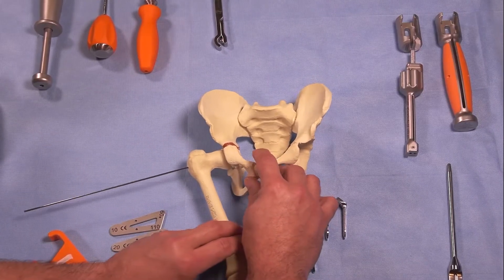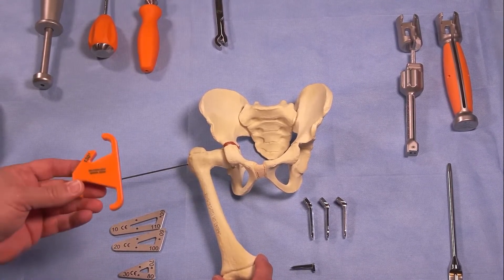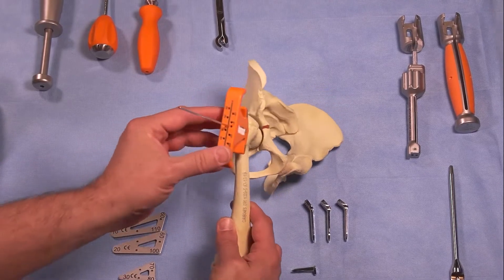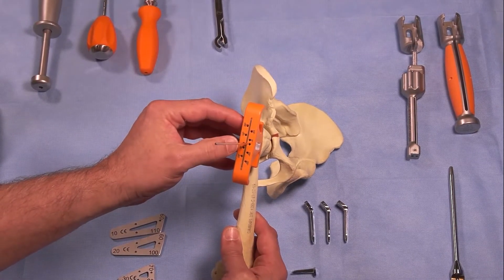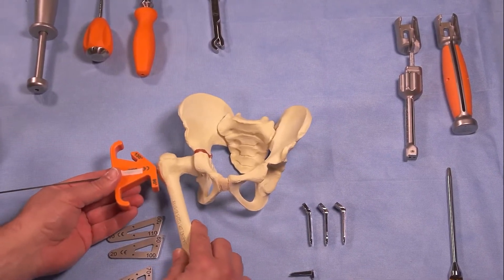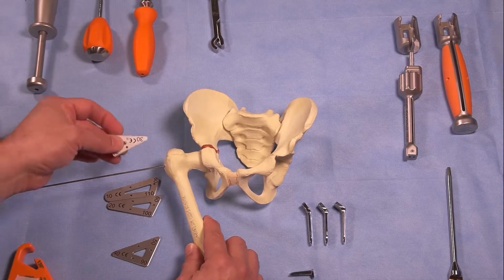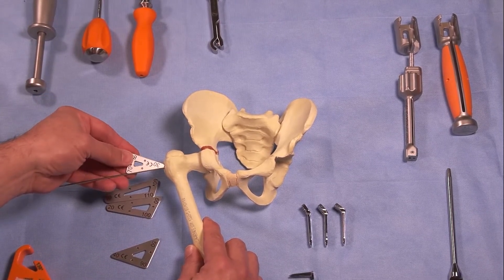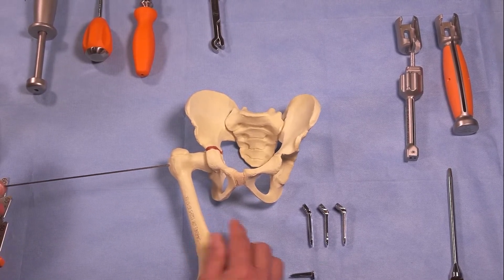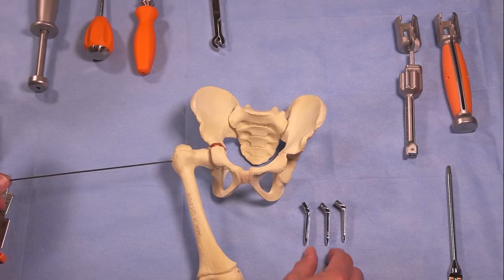Once that is accomplished, we start with inserting the chiseled blade. If you're having problems inserting the 1-1 position, this is a guide you can place in the center hole. It has different markings for 5-degree divergent, 10 degrees, and also different translations, so you can use this to fine-tune your first wire. You also have triangles that you can use to subtend a wire at a 30-degree angle. But the whole premise of the set is to place a 1-1 wire, place your chisel blade into that position, and then choose the appropriate angled plate to achieve your correction.